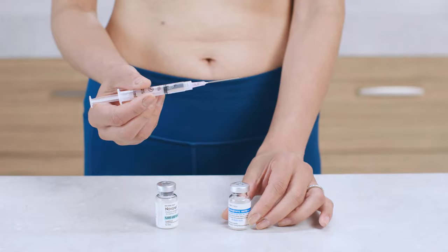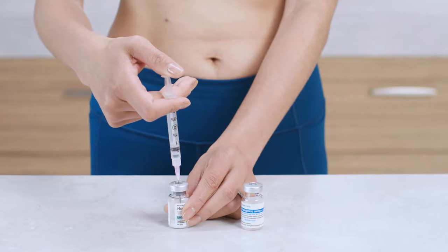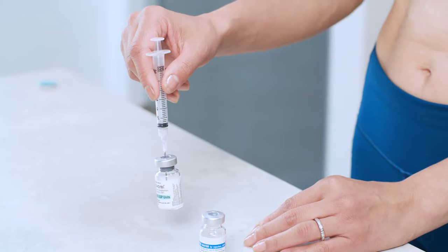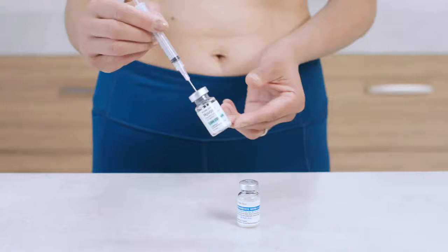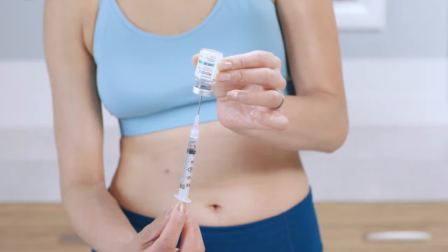Now place the vial of powdered Novaral on a flat surface, take the syringe you just prepared, and slowly insert the needle through the rubber stopper. Holding the syringe at a slight angle, slowly push the plunger to inject the solution. With the syringe still inside the vial, gently swirl until the solution is dissolved. If the solution isn't clear or you see any particles floating around, don't use it and call your healthcare provider right away for next steps. Without removing the needle, turn the vial upside down and make sure the tip of the needle stays submerged in the solution as you slowly pull back the plunger to withdraw your dose.